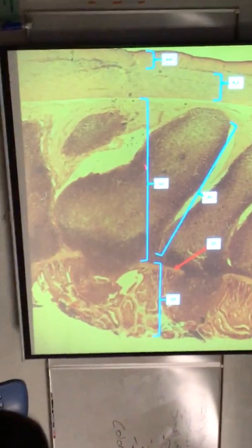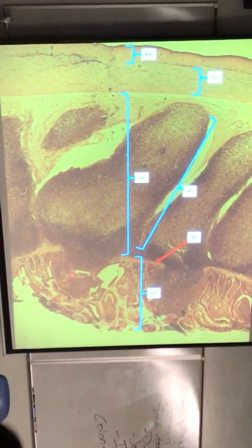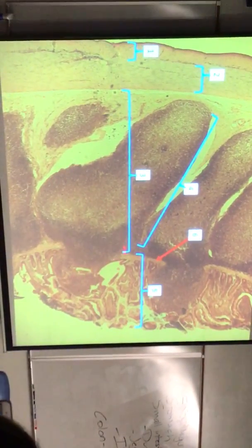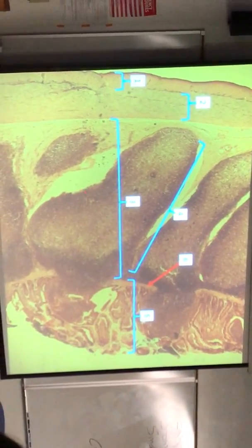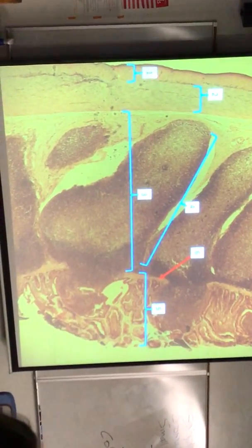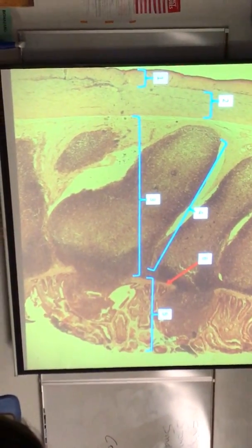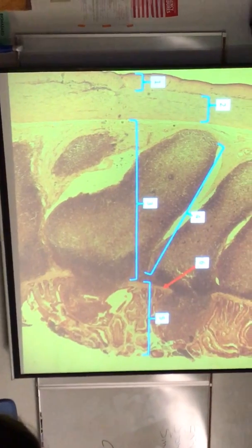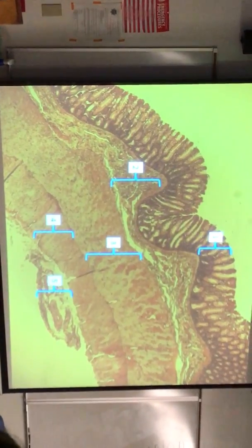Well, it's within number 3 here, the submucosa. We call it mucosa-associated lymphoid tissue because it kind of goes up into the mucosa there. So you kind of have a break in here. Number 6 is pointing to muscularis mucosa. So number 5 is mucosa. We have our muscularis externa, our inner circular or outer longitudinal. That's ileum. So after ileum is large intestine or colon, shown here.